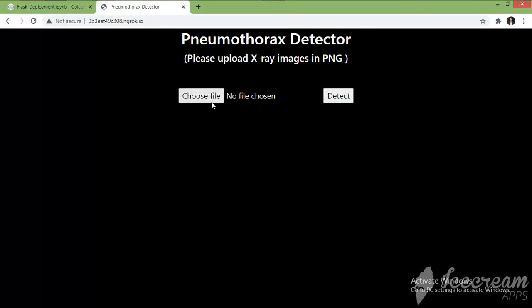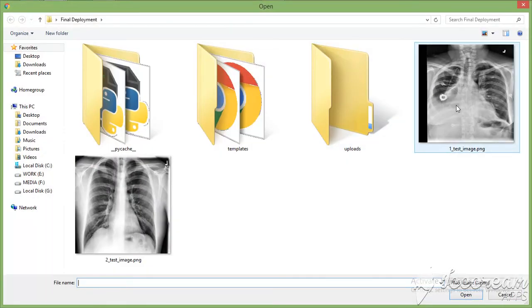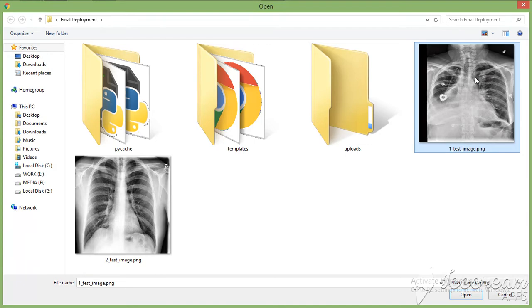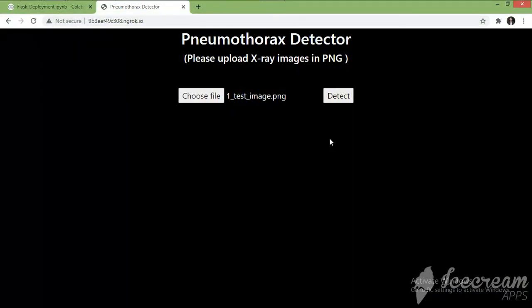Let's choose an image. You can see there are two images for testing — I will choose this first image. Before passing it to the model, we can see that it is difficult for us humans to say whether the disease is present or not by simply looking at the X-ray.